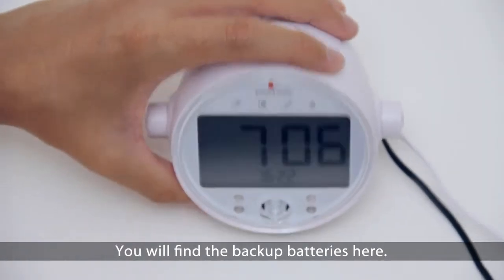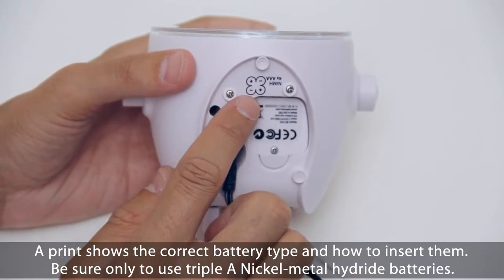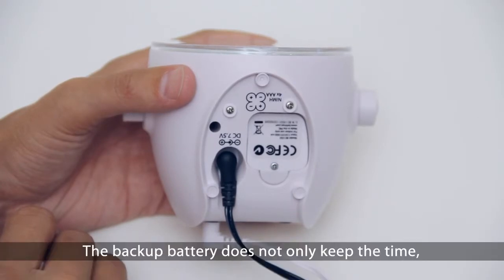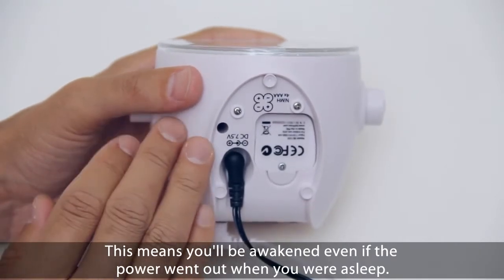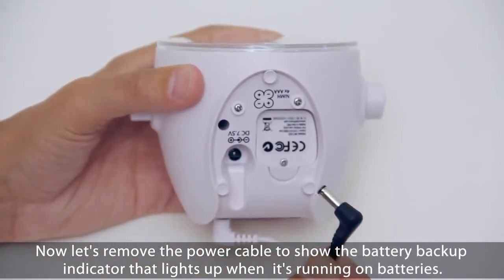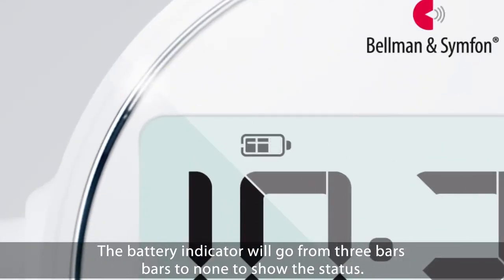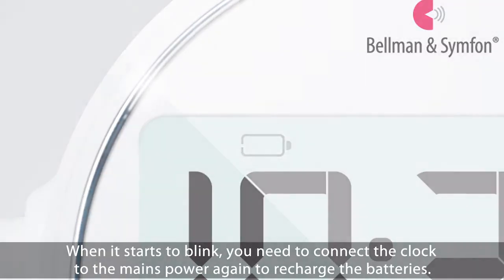You will find the backup batteries here. The battery lid is secured by a screw to prevent small children from opening it. A print shows the correct battery type and how to insert them. Be sure to only use AAA nickel metal hydride batteries. The clock's powerful battery backup will step in whenever the power goes out. The backup battery does not only keep the time — it also keeps the sound, bed shaker, and flashing lights at full power. This means you will be awakened even if the power went out when you were asleep. Let's remove the power cable to show the battery backup indicator that lights up when running on batteries. As you can see, the batteries are now fully charged. The battery indicator will go from 3 bars to none to show the status. When it starts to blink, you need to connect the clock to the mains power again to recharge the batteries.